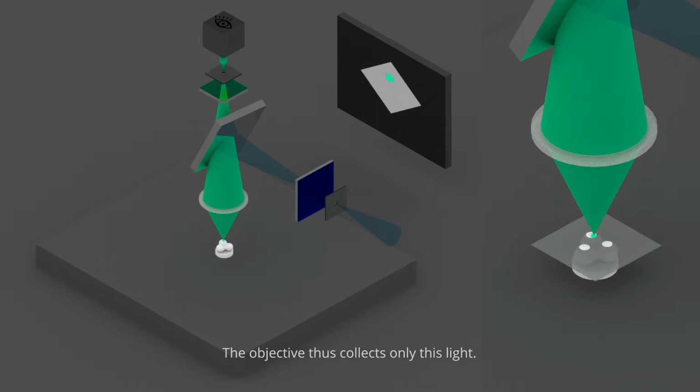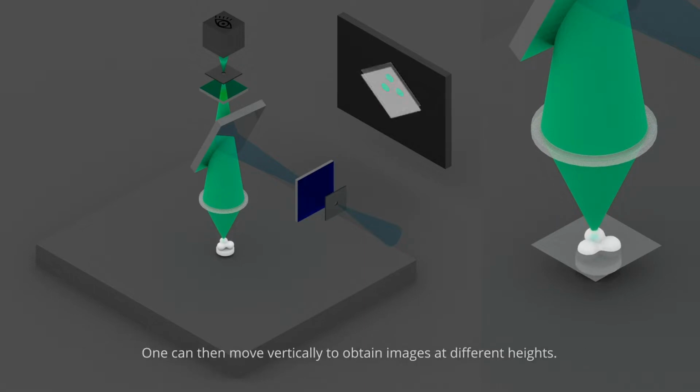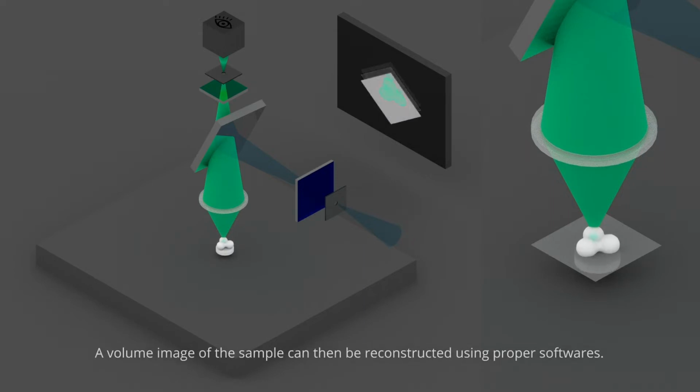We can notice that only when the focus of the reflected light is at the same distance from the focus of the emitted light, the light beam can be imaged on the sensor chip through the small hole. We can adjust the imaging plane of the emitted light to obtain the z-axis depth of the measured object, and adjust the X and Y positions of the focus through the MEMS galvanometer, so as to scan the three-dimensional information of the whole tooth. The principle is very simple, but the engineering implementation is quite complex, which involves four problems.